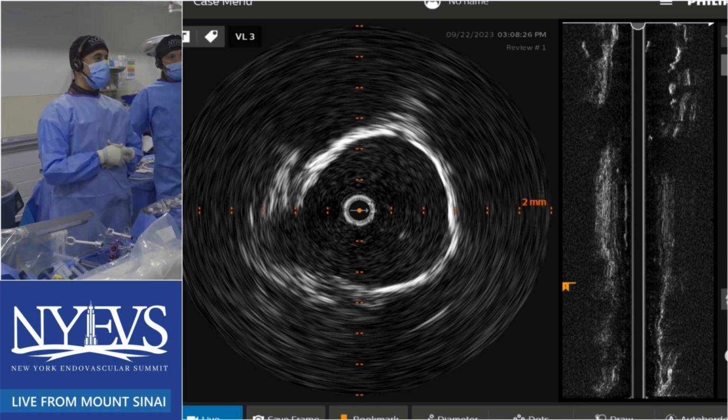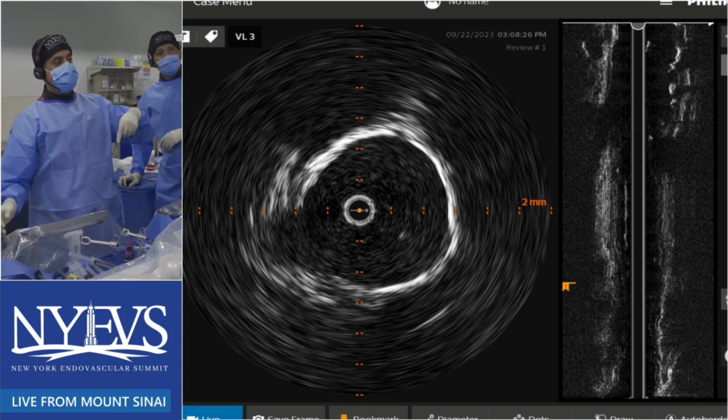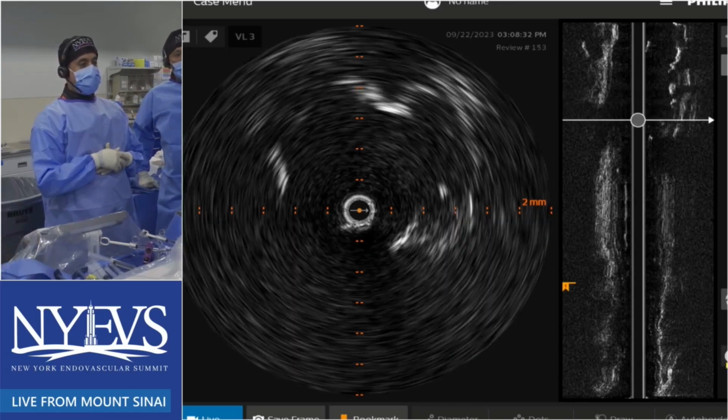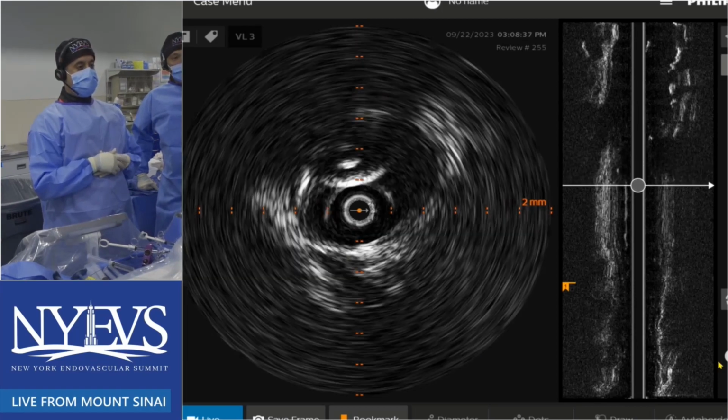And then we did an IVUS after that, and we're going to show you pictures. Well, let's show us the IVUS. So this is the left side again, starting in the distal aorta. Yeah, I can see the calcium's fractured pretty well. Look at that.